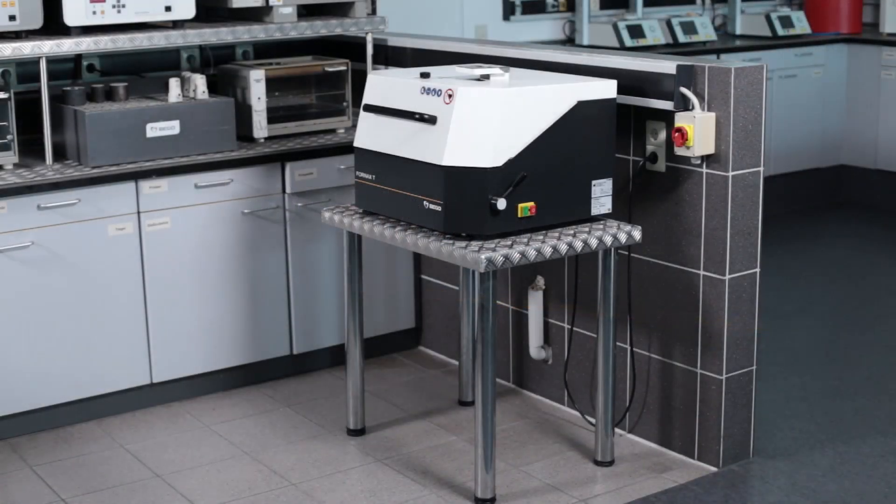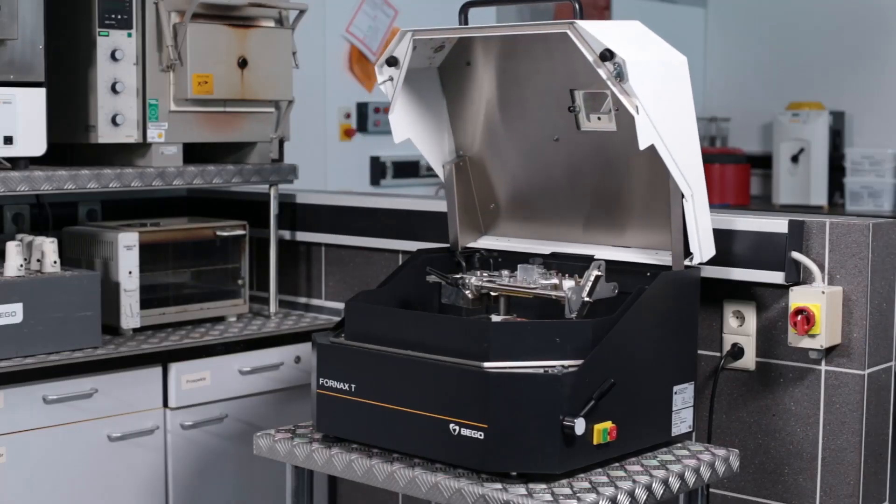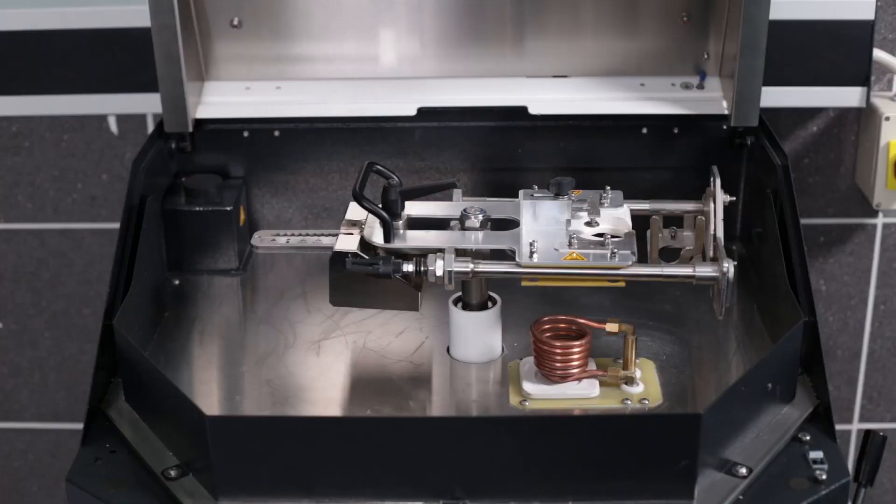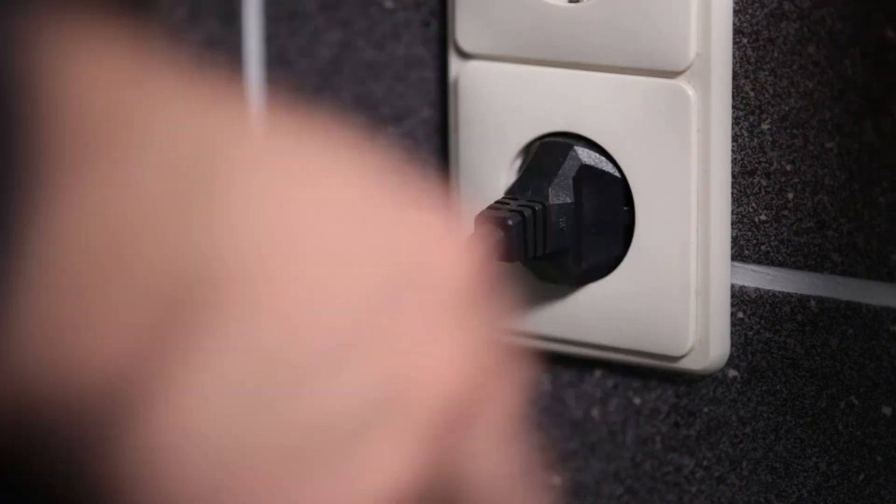The Fornax T is a tabletop device, hence the letter T. It is compact and a plug-and-play device. Before the first use, fill the internal cooling tank with water and connect the device to the power supply.